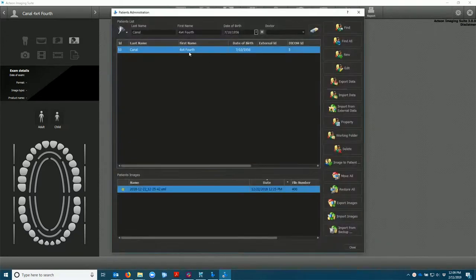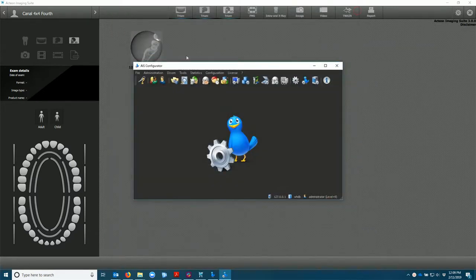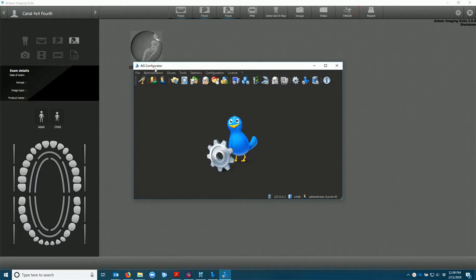Now we'll open just an individual patient in the patient administration window. We're going to go to AIS configurator, the DICOM selection.